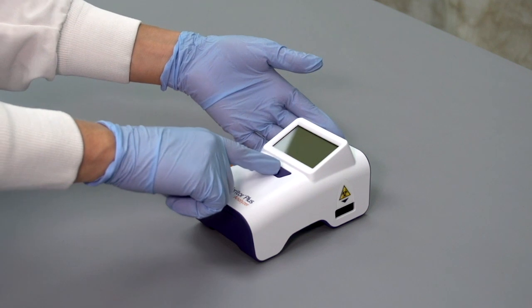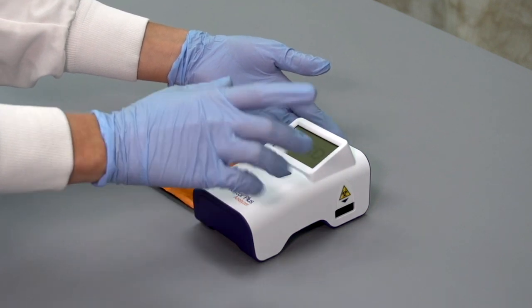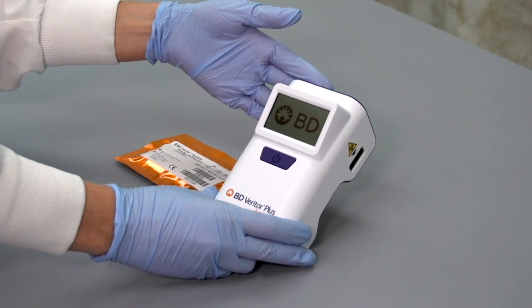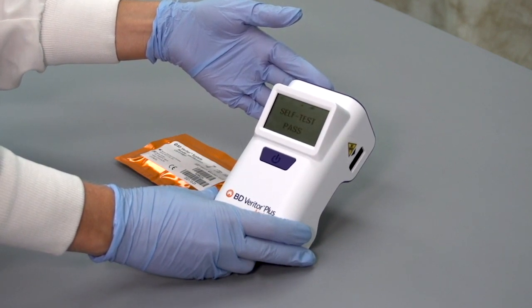To power the analyzer, press the center of the blue power button on the face of the analyzer and release. The LCD screen will show the BD logo during startup.